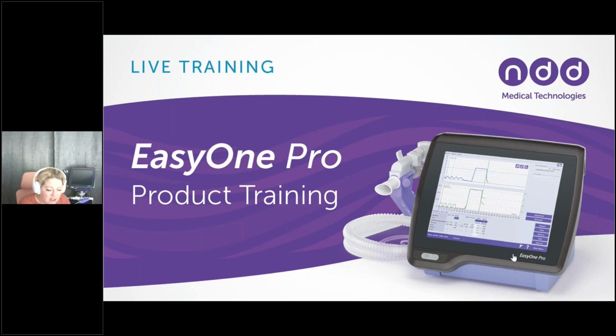All right. Well, this training always goes a little bit faster just because we are only talking about this one test today. Obviously, we can answer questions about spirometry because that does kind of go hand in hand with the DLCO test, needing to have the spirometry in the same day on the device. But I know that I have a helper on with me kind of manning the question tab. So I cannot remember who is there today, but whoever's there, do we have any other questions that we want to address from the chat bar?